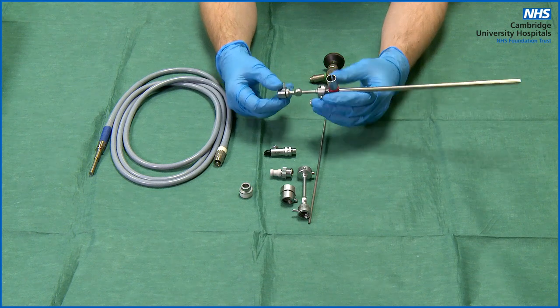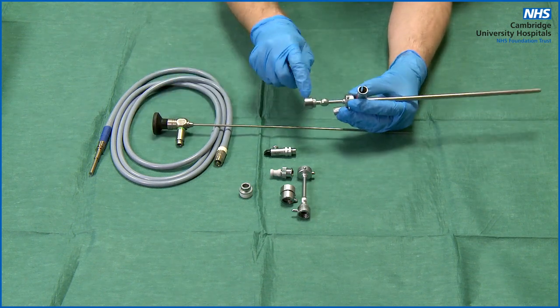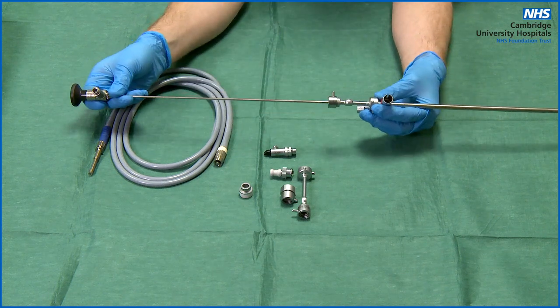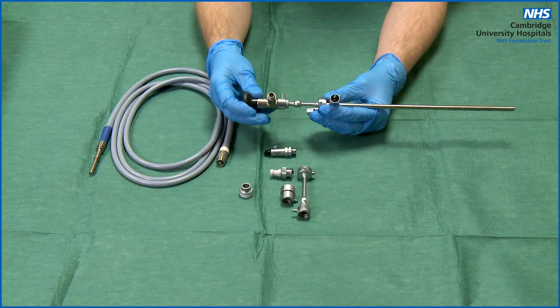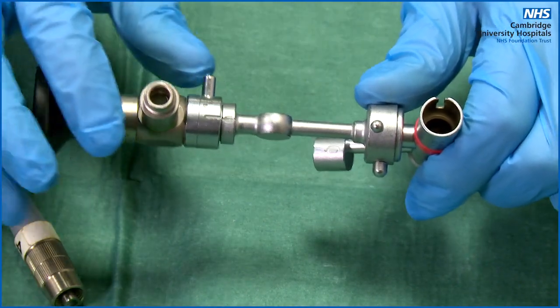To insert the telescope, first find the markers on the side of the bridge and make sure they are lined up — this is the unlocked position. Insert the telescope, then to hold it in place, turn the top of the bridge clockwise so that the two lines no longer line up. You should never need to use force in this process.